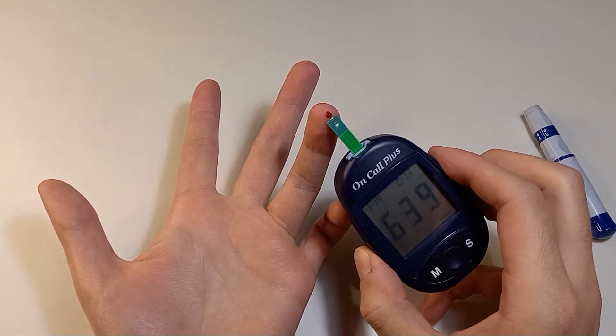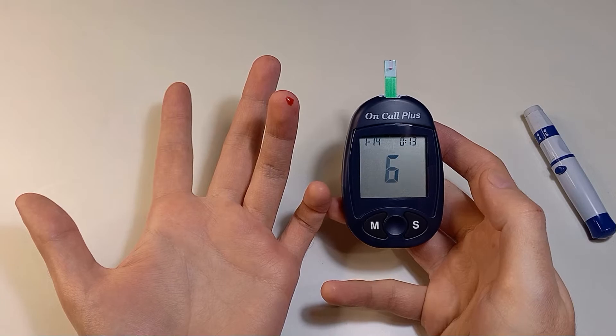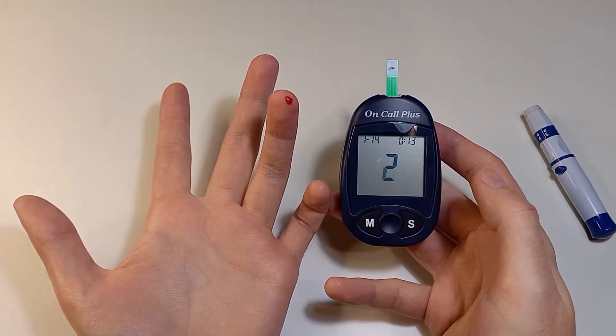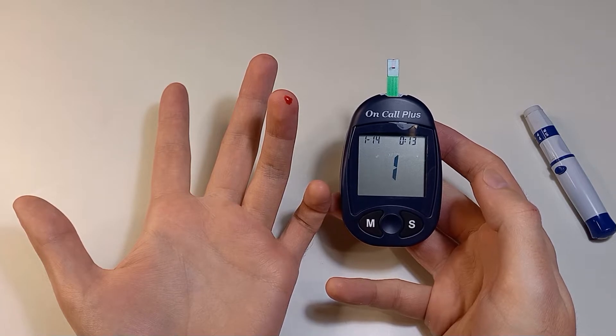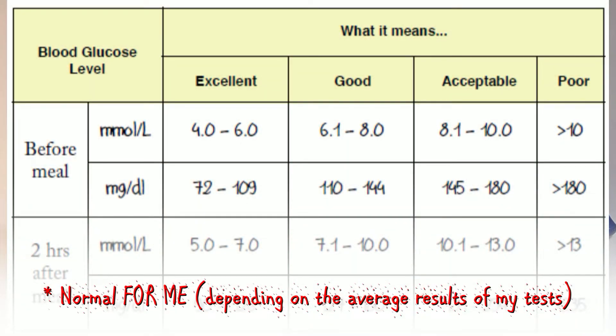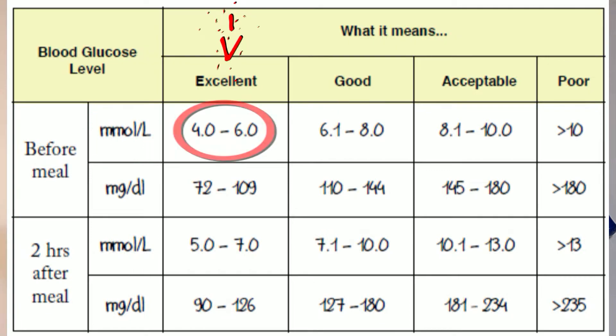Take the device and touch the blood drop with the top of the test strip. You have to wait several seconds and the result will appear on the screen. Today I have 6.4, which is slightly higher than normal. The table says 'good' and 'acceptable' but these are quite high blood sugar levels.